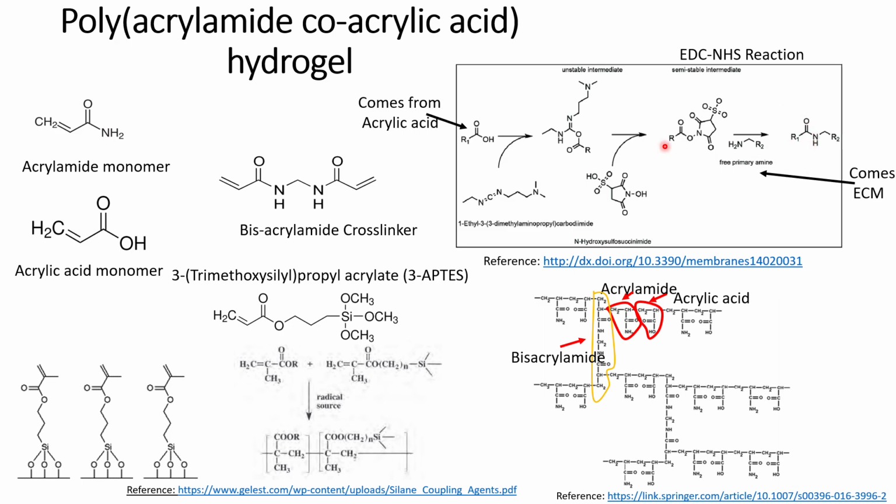Thereafter the hydrogel is ready for cell culture, as it will now be populated with the desired extracellular matrix protein. So this is how polyacrylamide co-acrylic acid hydrogel is formed and functionalized.